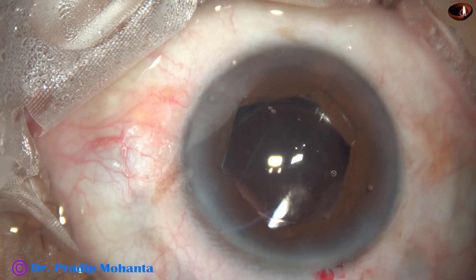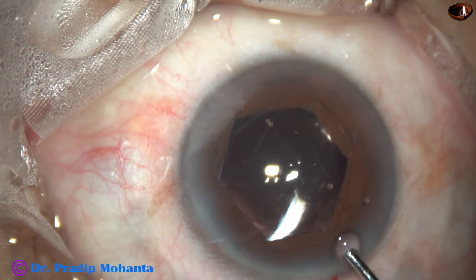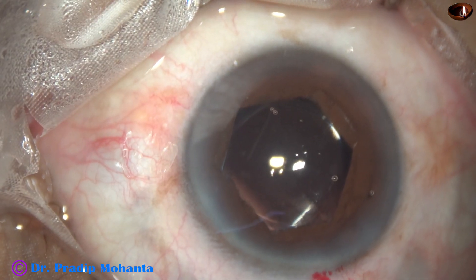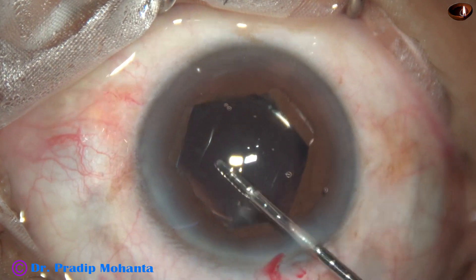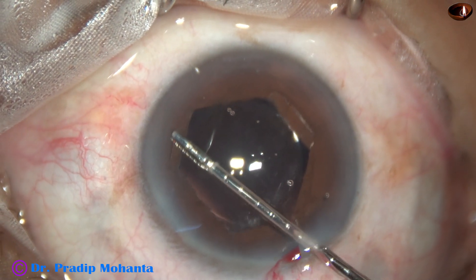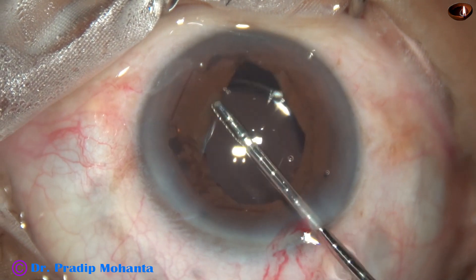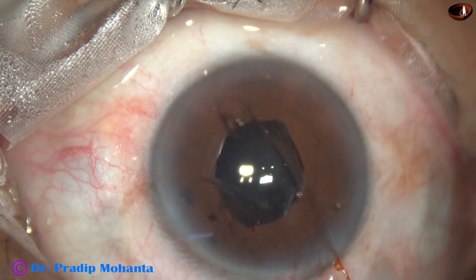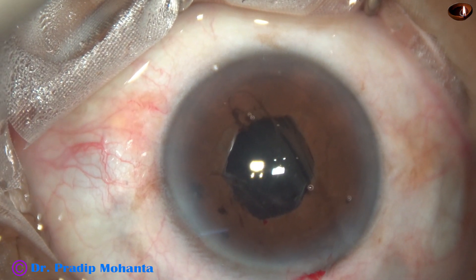Now it is time to remove the B-Hex ring. Some more visco is injected. It is easy to remove the ring — just hold the flange, pull it centrally, go peripherally, and the device comes above the iris and is pulled out.